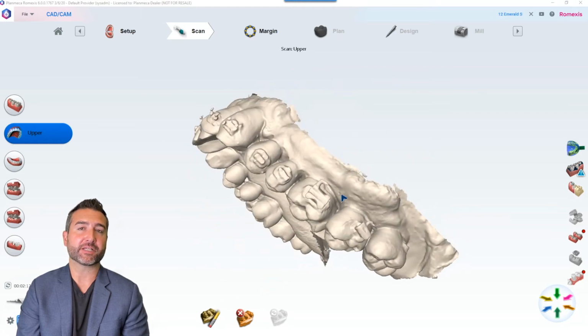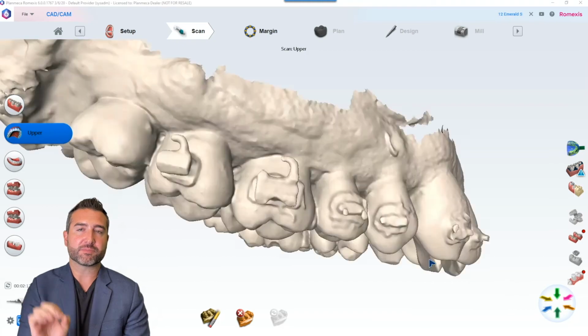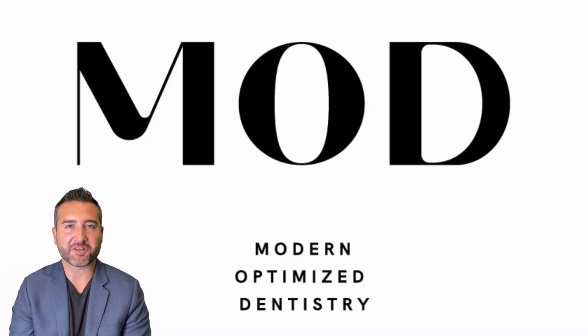I never would have imagined 5 years ago that we would be able to scan that fast and with this clarity. Brackets, you could even see the tiny little arms of the bracket extensions, those elastic retainers. Oh, this is just fantastic.